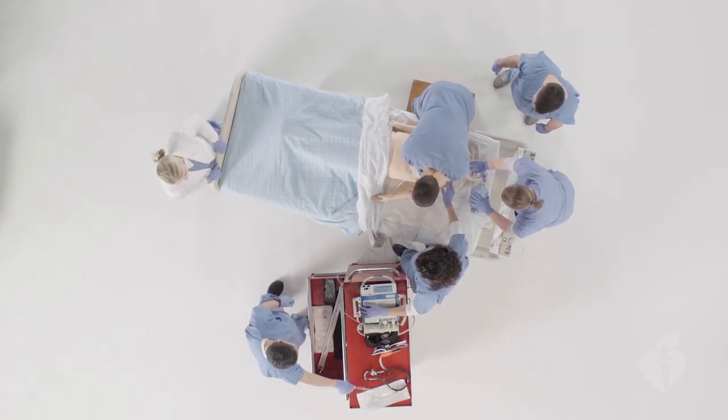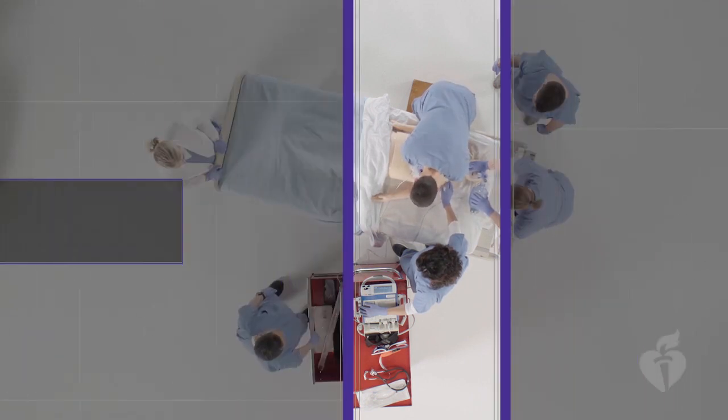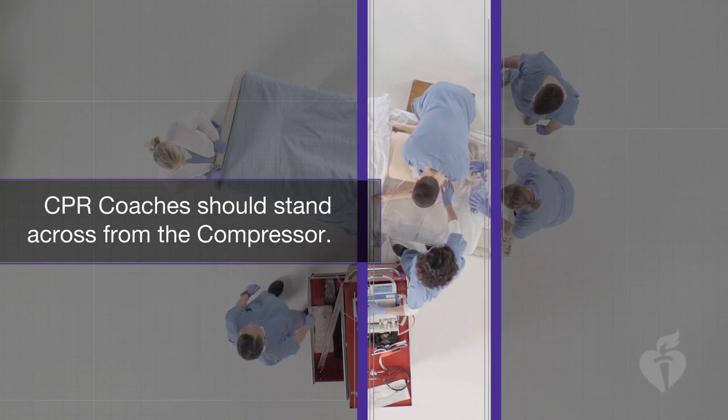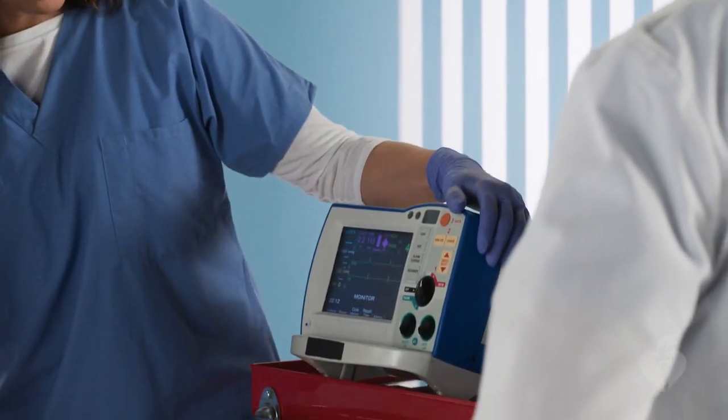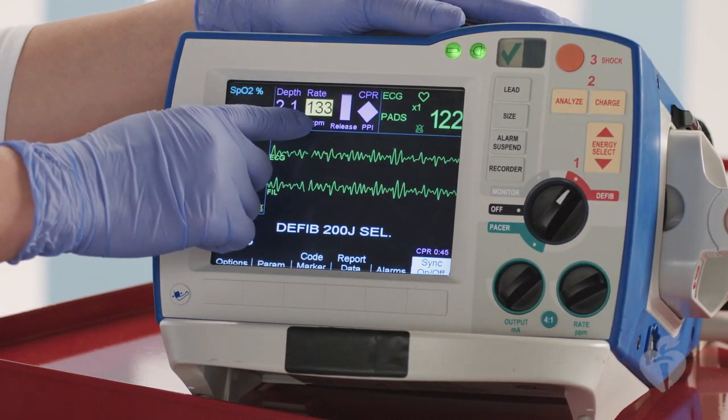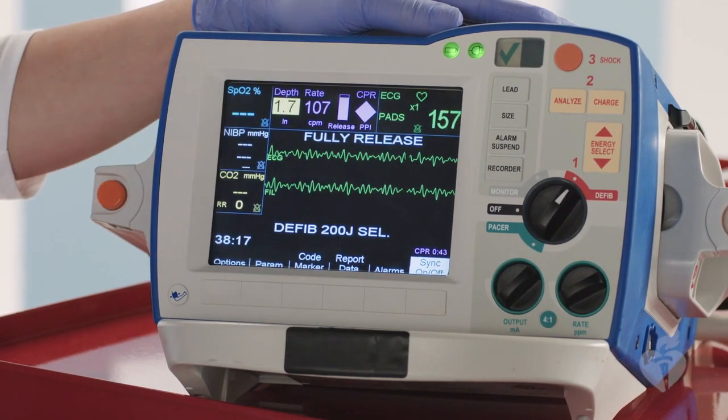First, let's talk about the team layout when using a CPR coach. CPR coaches should stand across from the compressor, always in the compressor's direct line of sight. CPR coaches should also stand next to the CPR feedback display, which is often located on the defibrillator, so that they can effortlessly redirect the compressor's attention to the data provided by the feedback device.